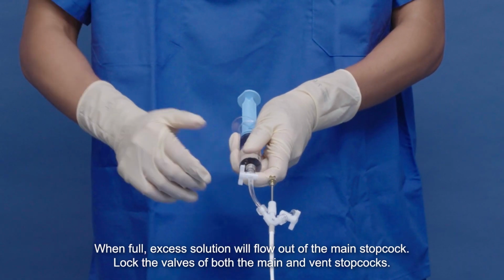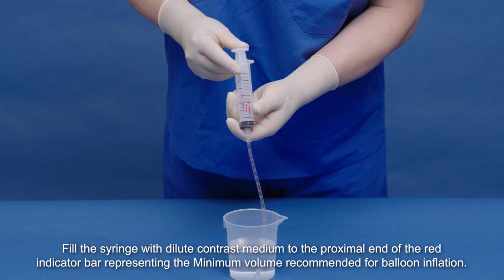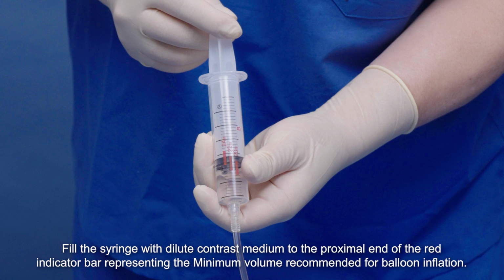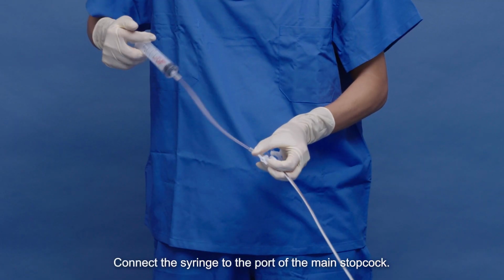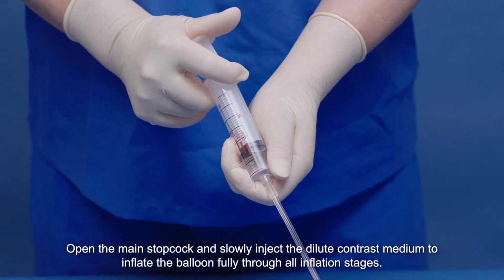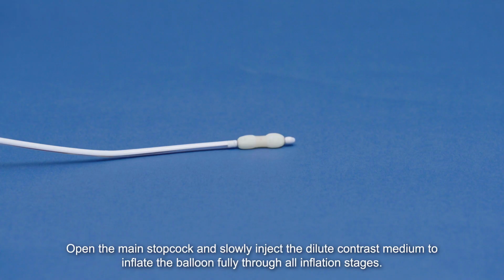Lock the valves of both the main and vent stopcocks. Fill the syringe with dilute contrast medium to the proximal end of the red indicator bar, representing the minimum volume recommended for balloon inflation. Connect the syringe to the port of the main stopcock. Open the main stopcock and slowly inject the dilute contrast medium to inflate the balloon fully through all inflation stages.